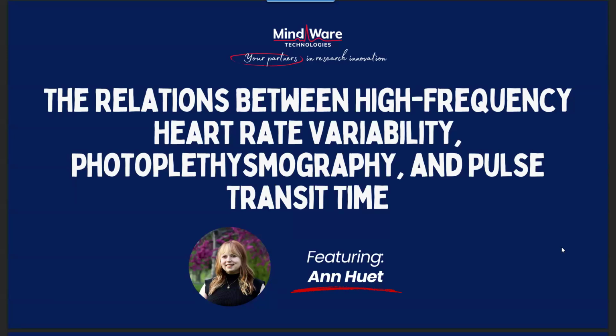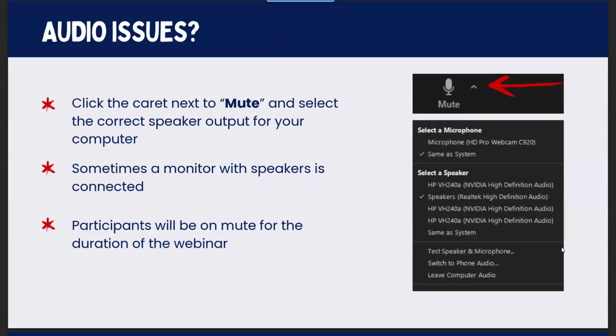And for today, we are going to be kicking off our 2026 webinar series by talking about the relations between high frequency heart rate variability, photoplethysmograph, and pulse transit time.